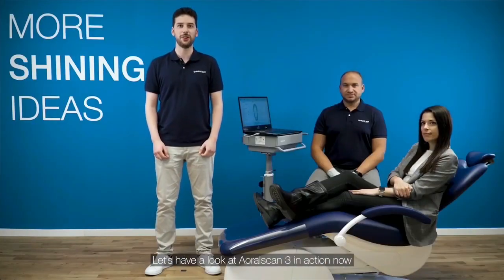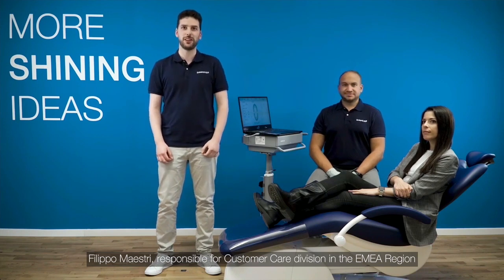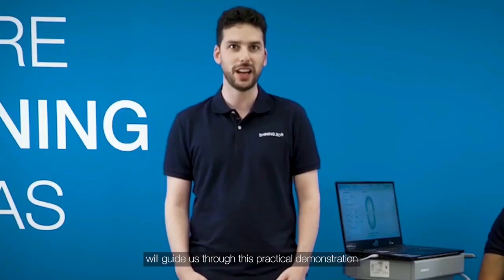Let's have a look at Aoralscan 3 in action now. Filippo Maestri, responsible for Customer Care Division in the EMEA region, and Rita D'Amico from Sales Department will guide us through this practical demonstration. Thank you, Riccardo.